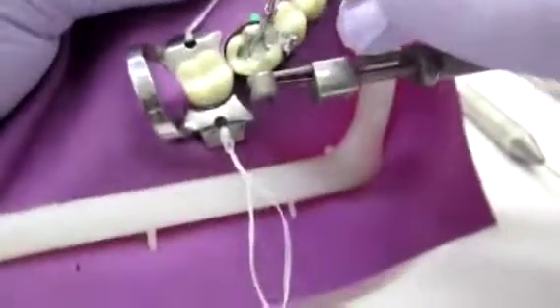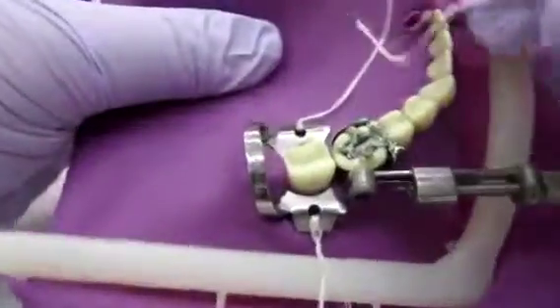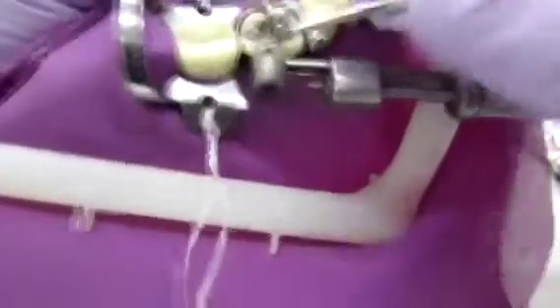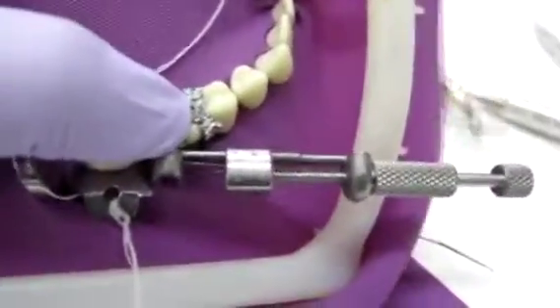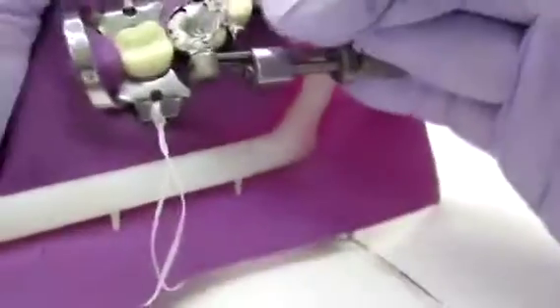Now I'm starting to condense the occlusal. You want to condense buccal and lingually — you're not going to condense straight down. It's going to get into the corners of your prep and you need every single space in there condensed. I'm going to use the bigger end of the carrier because now we're working on the occlusal and we're higher up. So we can start condensing and getting some of that filled. There's not as much small cracks so you don't need to use the small one — start using the big condenser. But again, listen for that crunching sound, and go buccal and lingual.